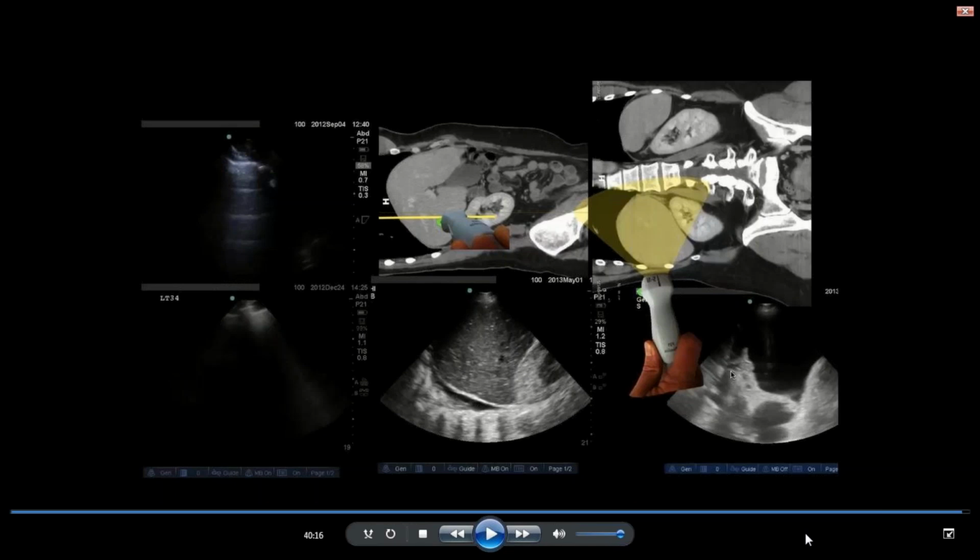And I think when you're struck by the absence of the smoothness of a pleural lining, in other words, if you find that the pleural lining is sliding, but it looks, let's say, lumpy and bumpy, or rather irregular, or you begin to notice nodularity, those are all clues to something going on that would point perhaps towards a pleural process.